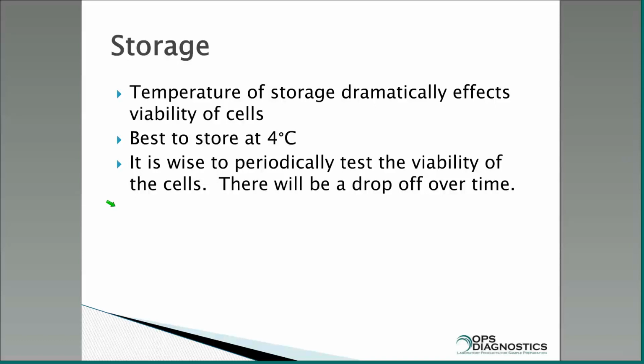Storage. Temperature of storage is a big deal. Cells will not remain viable forever, and if you try to store your cells at 4 degrees, your cells should remain viable. But if you try to store them at a higher temperature, you might have some real issues. In the past, we have had people who have insisted that we do accelerated shelf life on freeze-dried cells, and it's a real disaster.